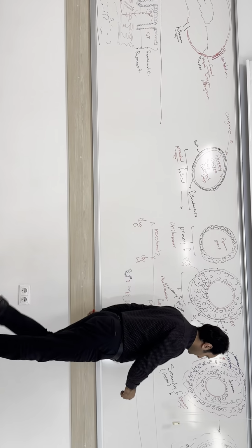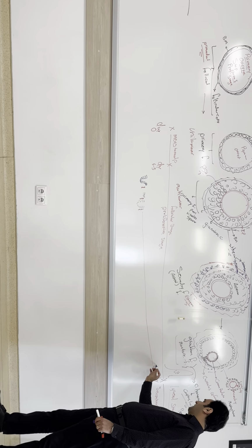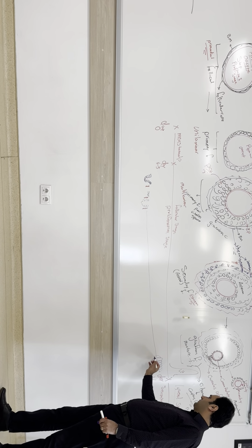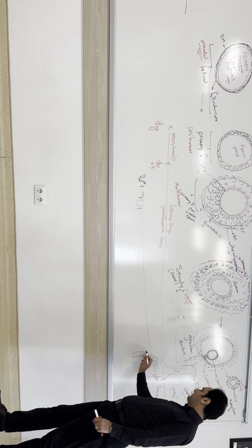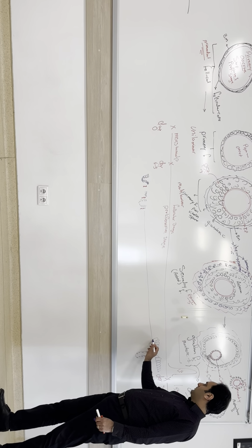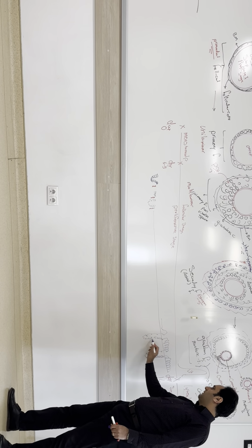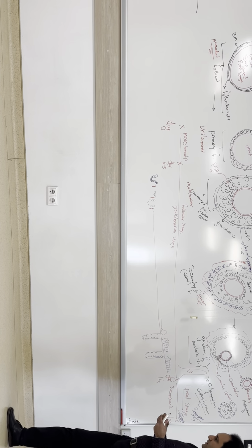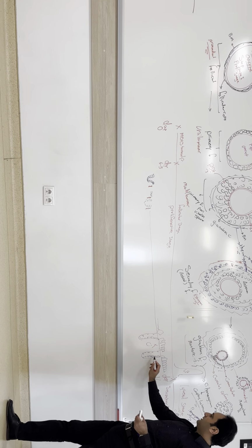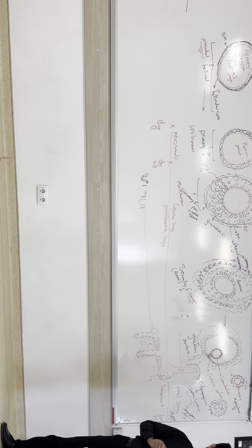At the end of the proliferative stage, on the surface of endometrium, again we have simple columnar epithelium with straight glands and normal connective tissue. Here you can see the connective tissue, straight glands, don't forget, straight glands, and epithelium.